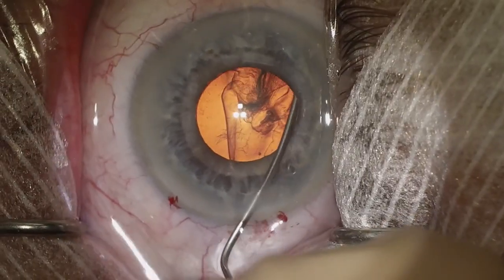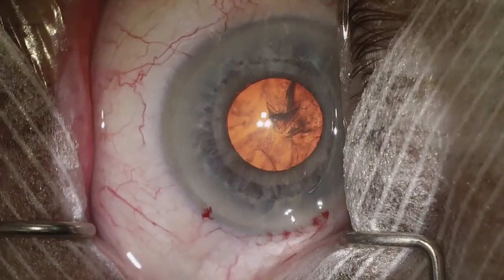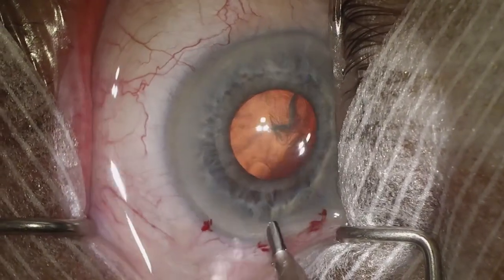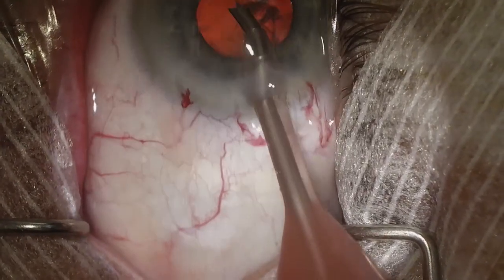We're going to tent up the capsule here as we hydrodissect. It's very common with these small pupils to get some iris prolapse, so if we see that happening we need to stop injecting BSS so the iris does not prolapse in these cases.